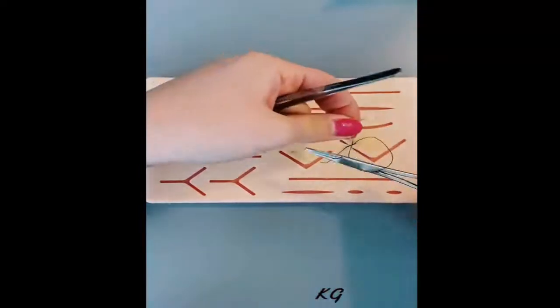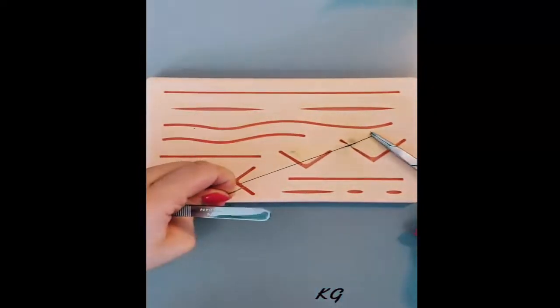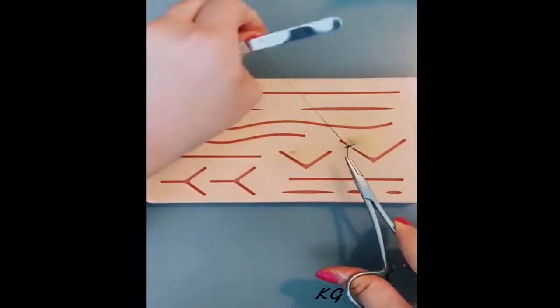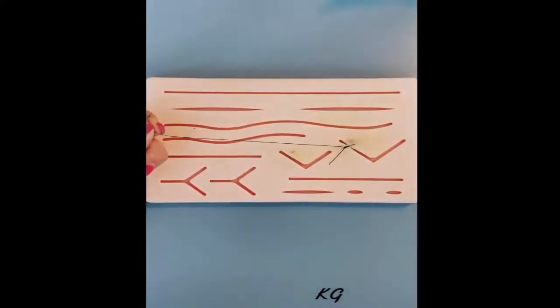Now in the opposite direction you make a single loop, grab that suture tail, lay it down flat. And then in the same direction that you started, single loop, grab that tail, lay it down flat. That's it. Now you cut, and you're done.